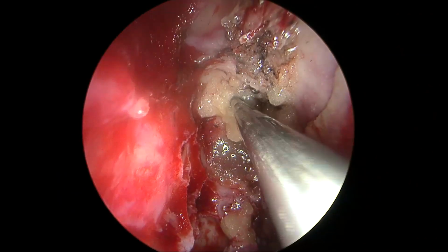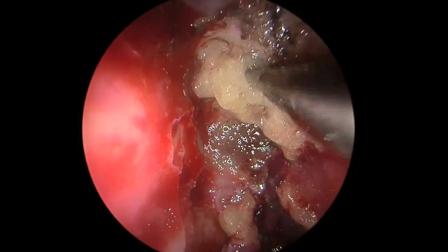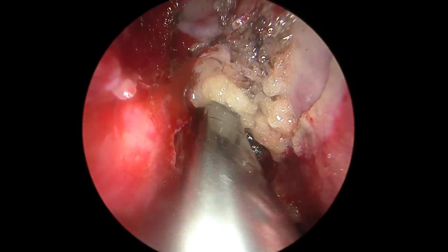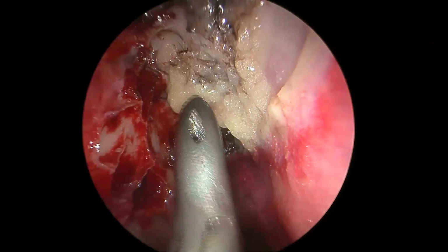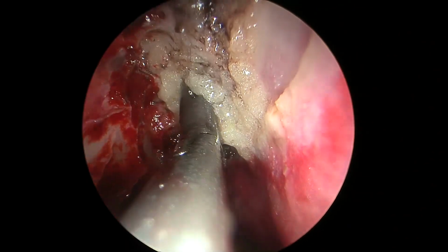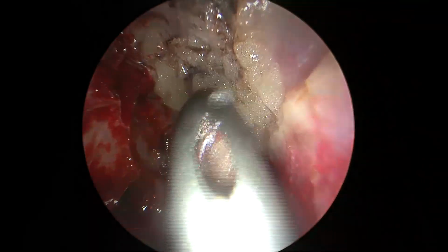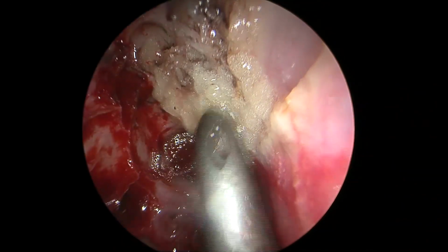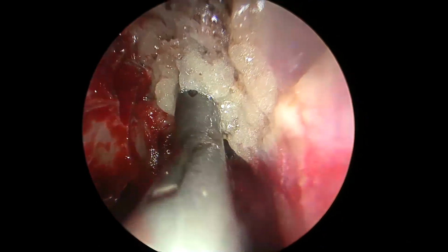We never use a ball probe for insertion because the ball probe will always keep getting the fat out. So we use any sort of straight flat instrument. It could be our Mason's elevator, it could be an angled elevator. We never use curettes, and sometimes a simple instrument like a curved Blakesley forceps is very handy. One has to not be rough here; just a gentle but sustained pressure onto the sides gives you a very snug fit of the fat.